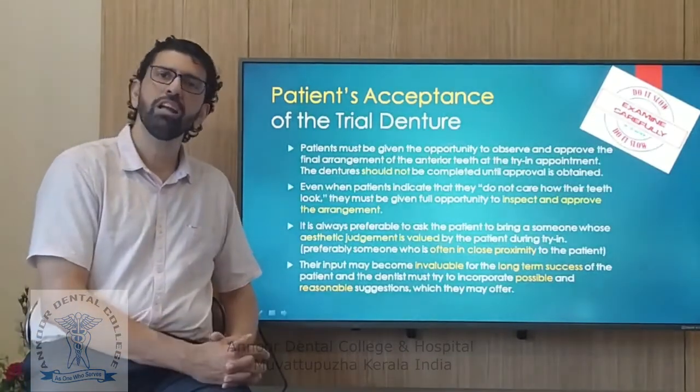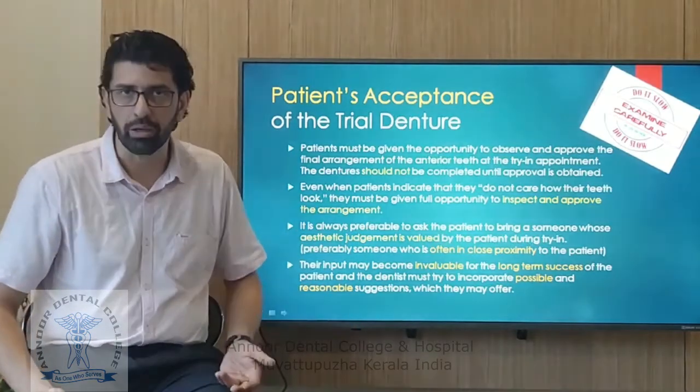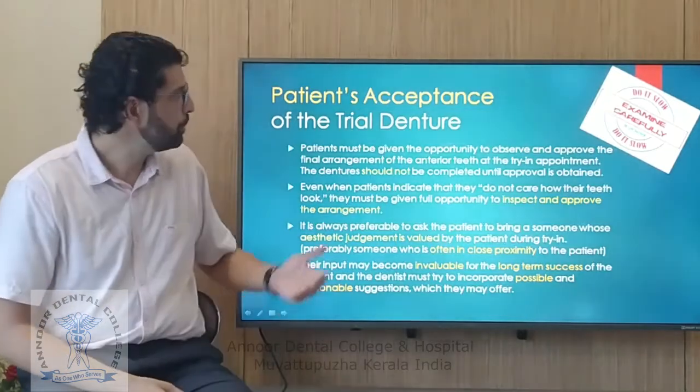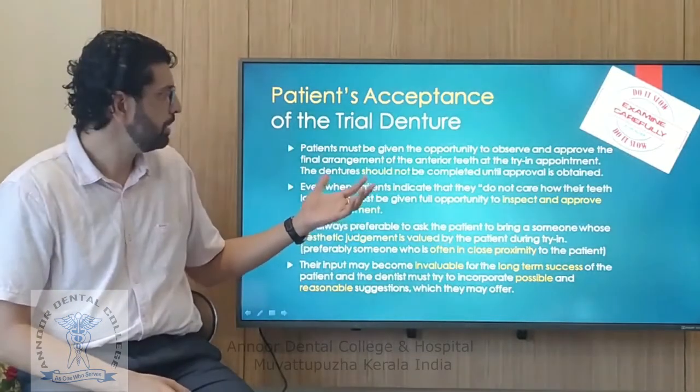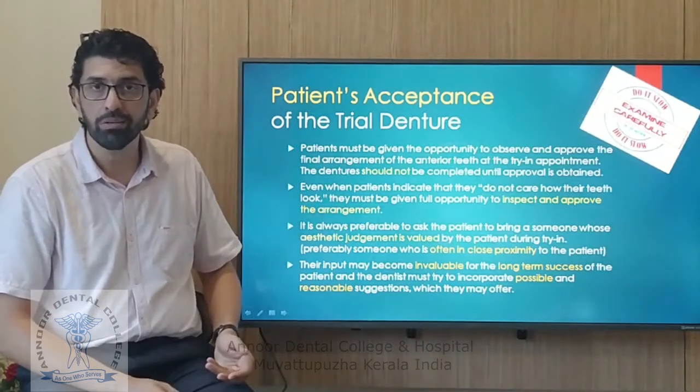Finally, after doing all this, you like the denture, you like how it looks, but that is only half the way. The real question is, does the patient like what he sees? So the patient needs to accept the denture, right? The patient must be given the opportunity to observe the denture, right?